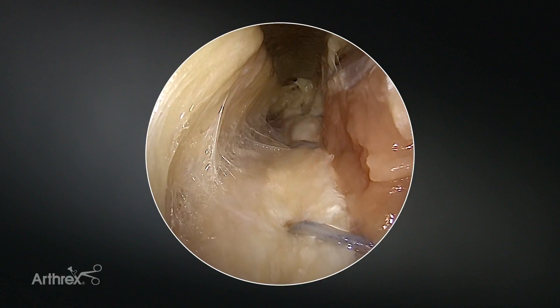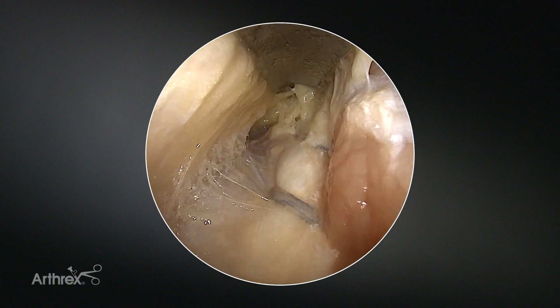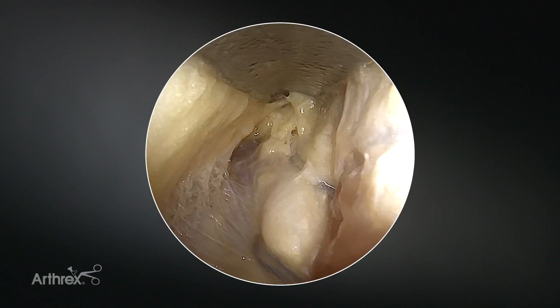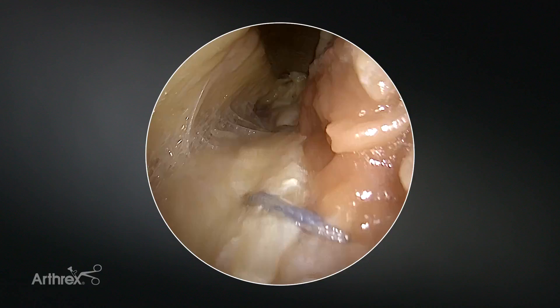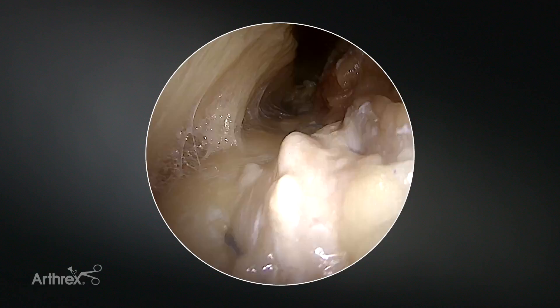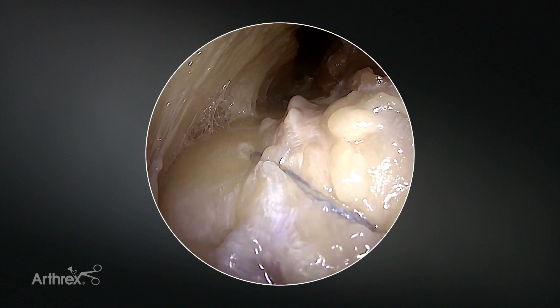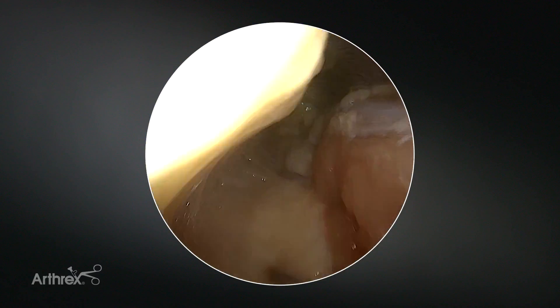Hi, I am Dr. Jim Guerra from Naples, Florida, and today I'm going to be describing a really slick technique on how to repair the quadriceps after you've done a quadriceps harvest for an ACL reconstruction. This is called the quad close technique, and it's a really slick and efficient way to repair the quadriceps in a side-to-side fashion, which is not only efficient and fast, but also extremely strong.